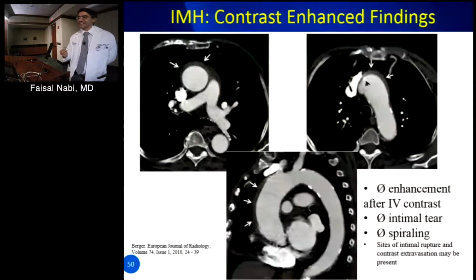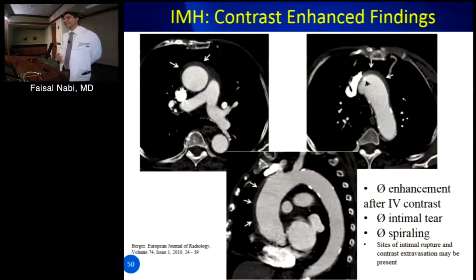Well, yeah, but thrombus is on the inside, because inside is in the lumen. But what you say, I'm assuming that you have seen with TEE something that is outside. You see outside, and it's this thickening that you see, and I get nervous. Sometimes you can have aortitis. I've seen some cases that are amazing.